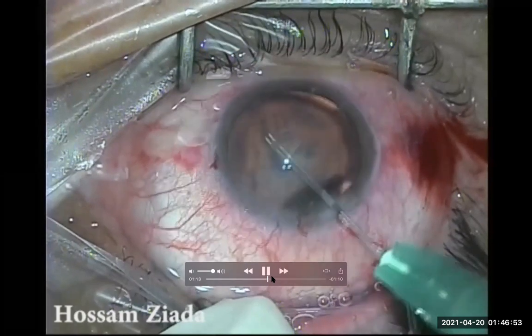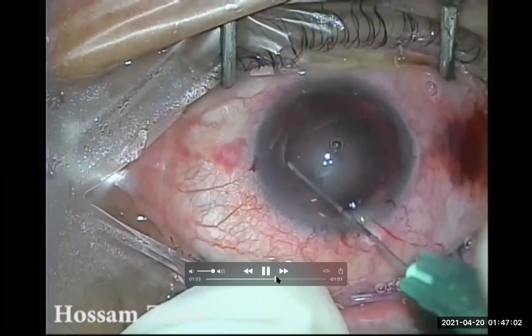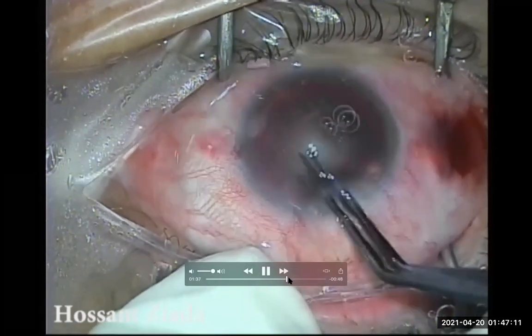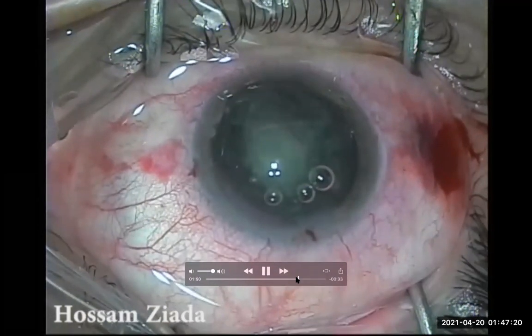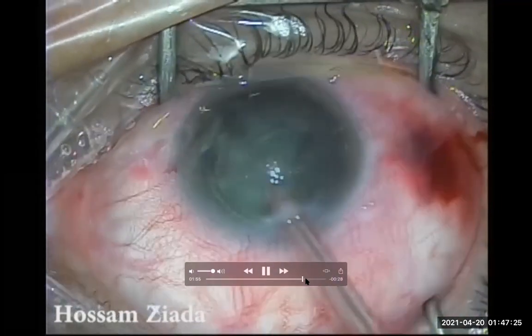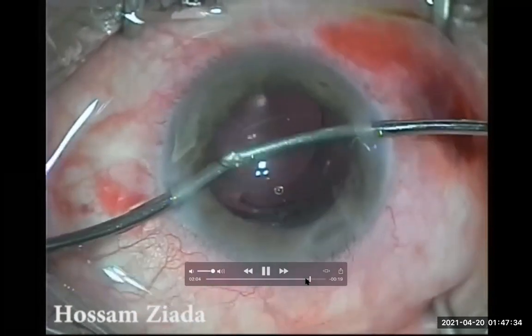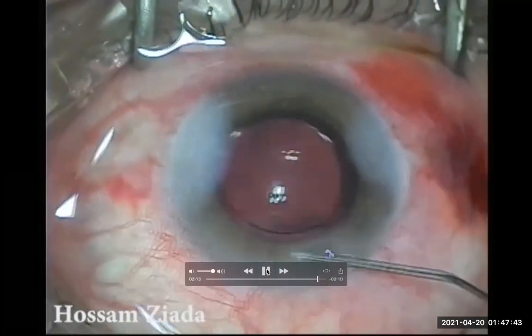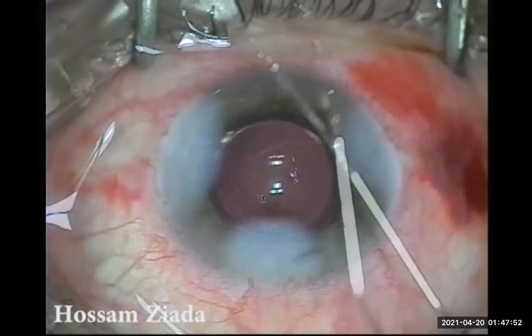With the new space in the anterior chamber, I could work very comfortably. I performed the capsulorrhexis as you can see, completed with capsulorhexis, then hydrodissection and hydrodelineation, followed by phacoemulsification with ease. Finally, I implanted the intraocular lens very comfortably under water without use of viscoelastic material, and performed stromal hydration.